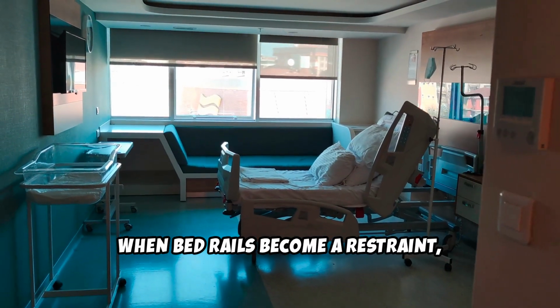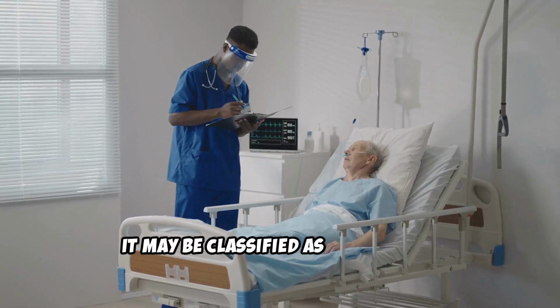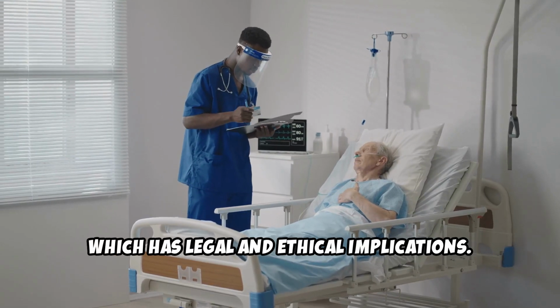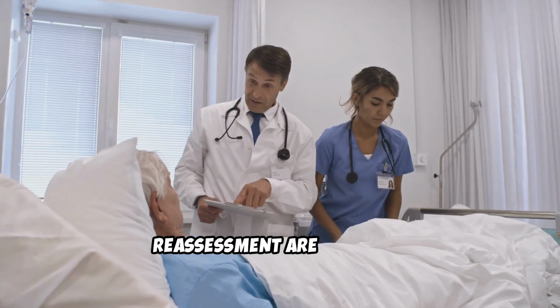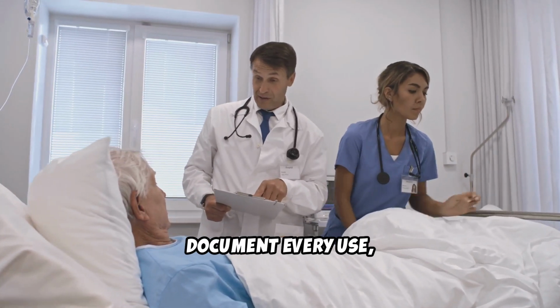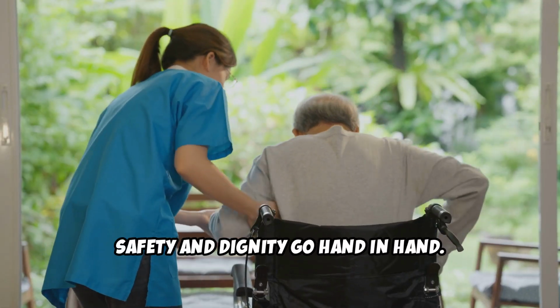When bed rails become a restraint, if a patient cannot lower or remove the rail on their own, it may be classified as a restraint, which has legal and ethical implications. In these cases, a physician's order and frequent reassessment are required. Document every use, justification, and alternative considered. Safety and dignity go hand in hand.